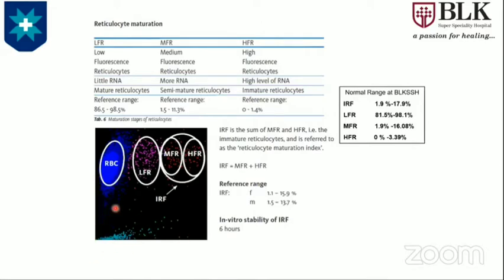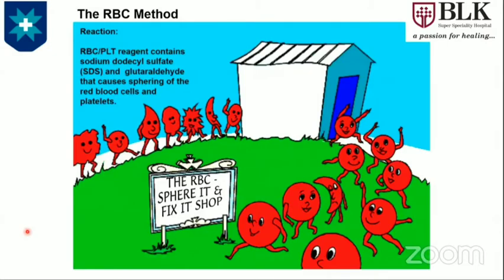And of course, what Dr. Jasmita did show us in one of her slides was the fragmented red cells. And we'll touch upon that a little bit in my subsequent slides. So the first important aspect is the spherization of the red cells. And the red cells can be of various shapes and sizes, and you make them go through a sphering system. In this particular analyzer, the reagent which is used is the VR diluent, and that helps you to make the cells into spherized balls. And eventually, some of the cells will escape, something like sickle cells, which will be picked up in the reticulocyte channel.